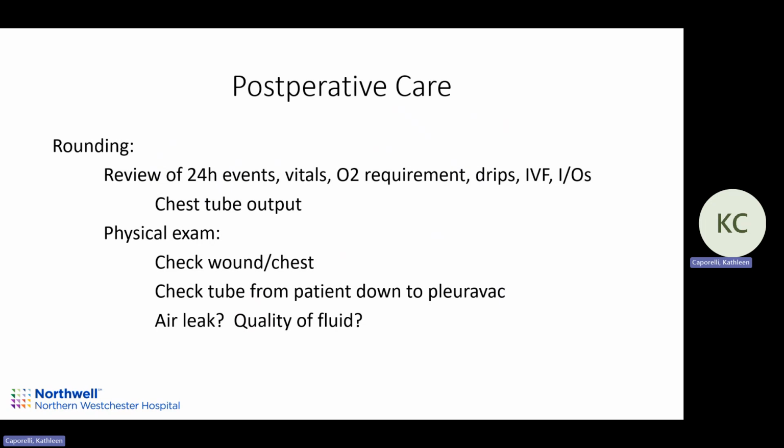And then I also wonder about the chest tube output. Obviously I look at the wounds, I look at the chest tube, and we talked about that. And then I want to look at if there's an air leak and then what's the quality of the fluid. Okay.